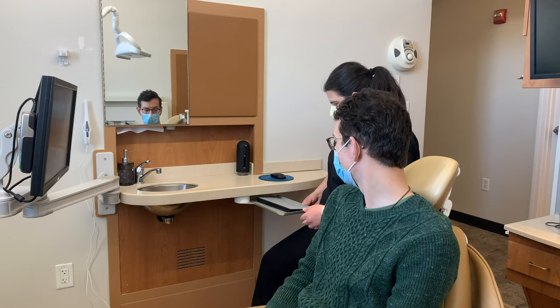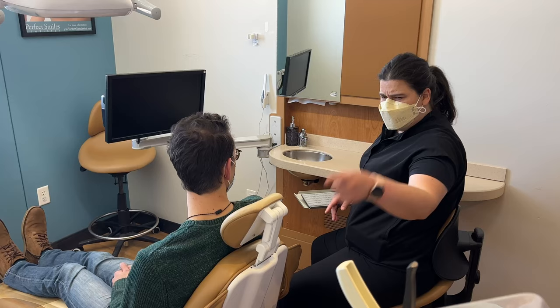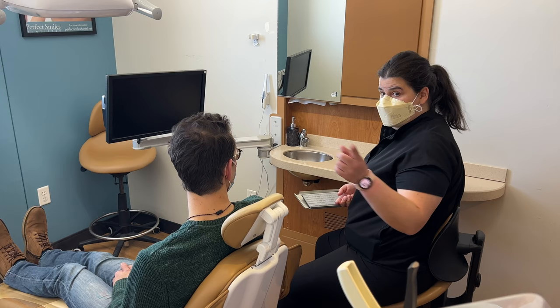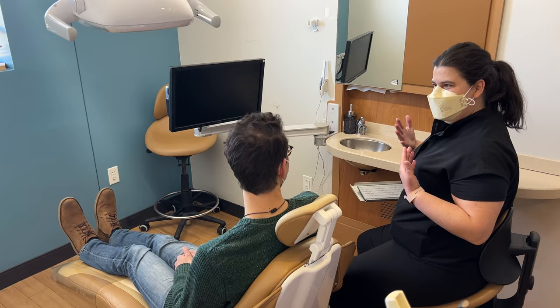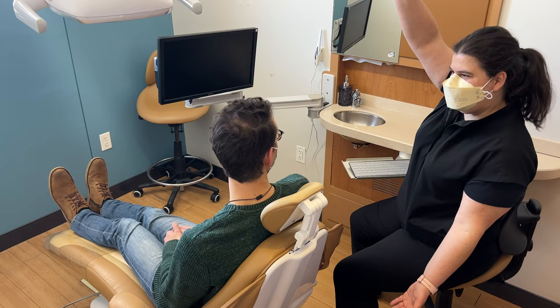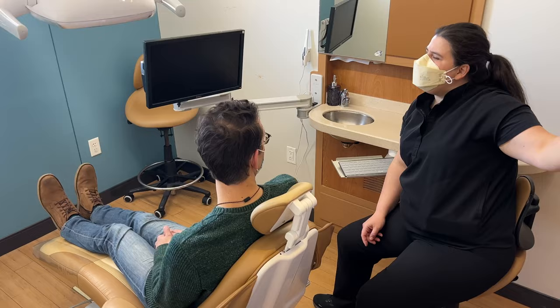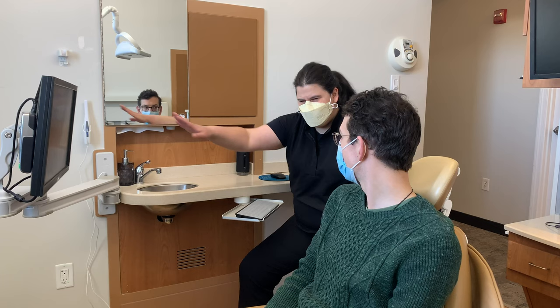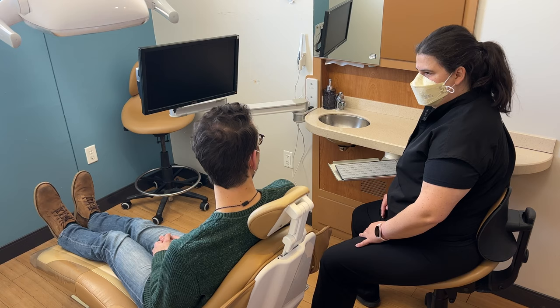When your image and series is ready to review with the patient in the chair, that can happen from both sides — you can have your assistant on the opposite side taking notes independently on the monitor behind them. More importantly, we're able to sit side by side and review an image together, with a little less of that typical intimidation you'd find in a dental office where someone's staring at you or asking you to turn your legs around to look at a screen. Two monitors side by side is a much better experience for the patient.